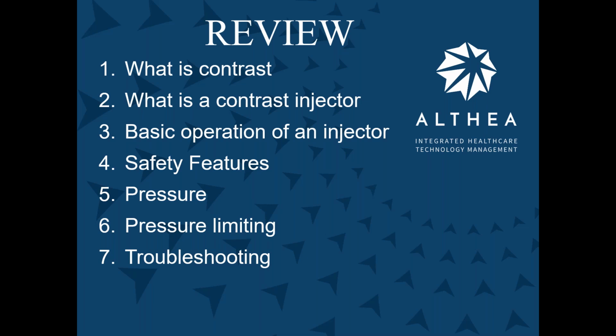At the pump, well, motor. That's what we need. Will a technician ever see a pressure limiting happen? Very rarely, because I can tell you right now, 90% of the CT injectors that I've seen are set at 300 PSI, and you ask them, can you change the PSI?